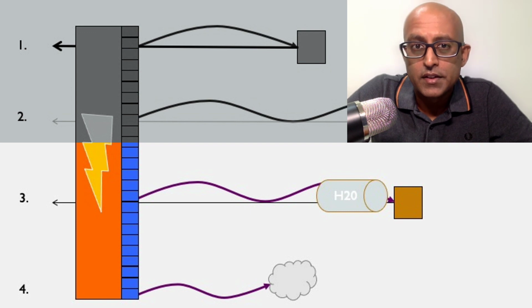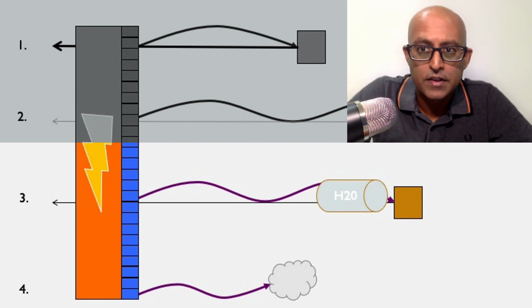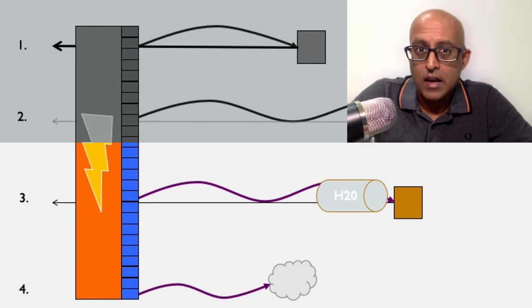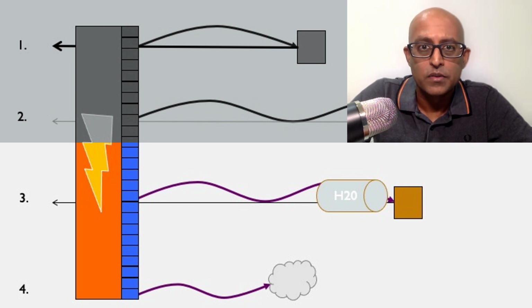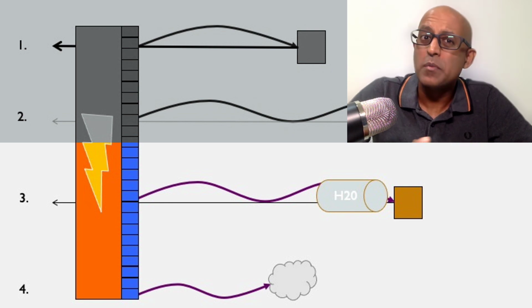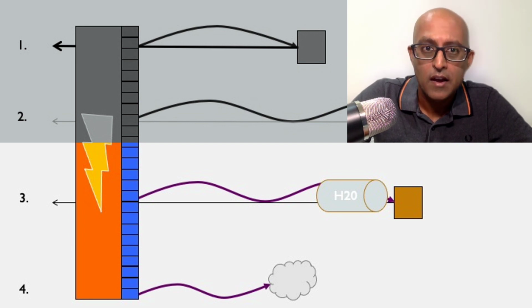The final thing to consider with ultrasound imaging is when you meet an air interface. If there is air on the tissue that you're scanning, and the ultrasound waves meet it, they'll be absorbed and won't be reflected back, and as a consequence you won't get a very clear image, or you may not see anything at all. It's similar to when you have your ultrasound transducer resting on the machine and you haven't applied the gel. You can't see anything on the image, and this is what you might find when you see air in the tissue.